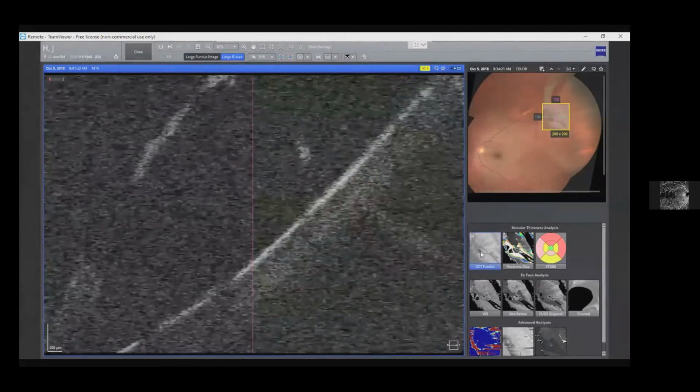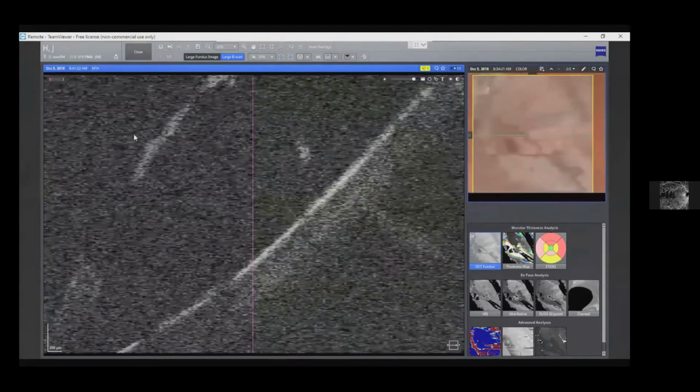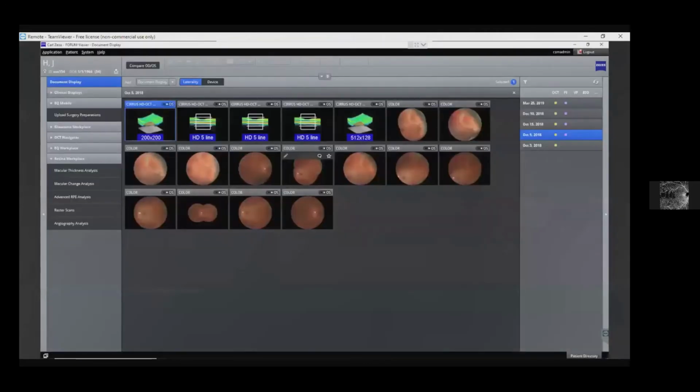Like I said, if you had just this instead to look at, you just really wouldn't know what part of the retina you're actually examining. So I find that very helpful. So that's patient HJ, again, a multimodal overlay assisting placement or localization of a peripheral OCT scan. So let's move on next to some of our longitudinal analyses examples.